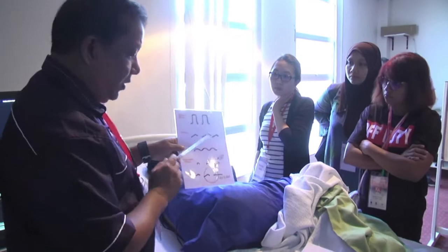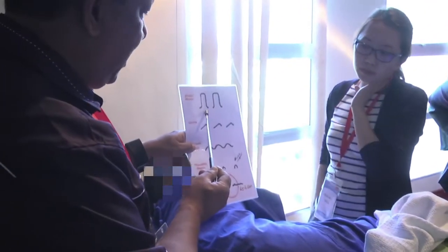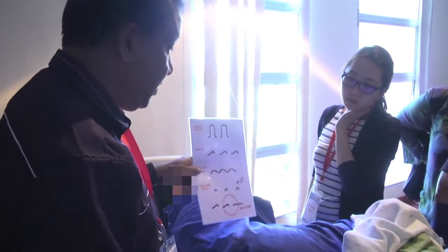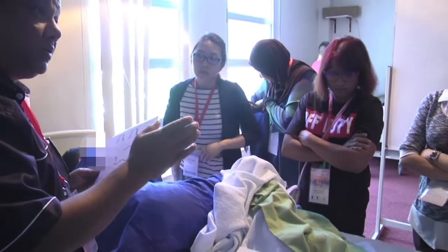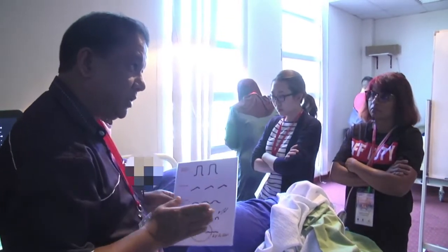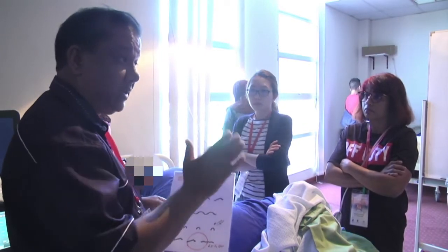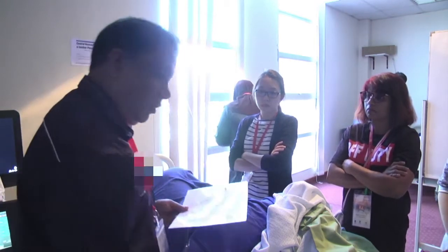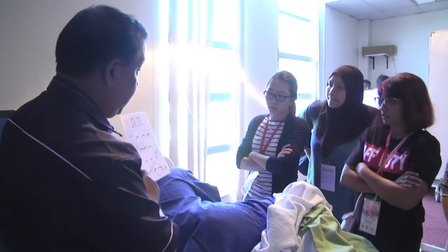Next, when you do a sagittal scan, in the midline we would normally see the spinous process like this. But this is not very practical because you know how the spinous process looks when you do it. The spinous processes are often, even in normal individuals, not lined up. Okay? There may be some variation. So when you do the scan, you may see L3 but no L4 and then suddenly L5. It's not because there's abnormality, it's just that there's some deviation, and the ultrasound being so thin, you can't recognize. So I don't find this very useful. The paramedian window is much more useful.